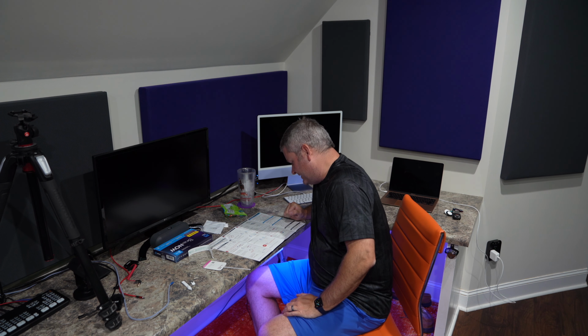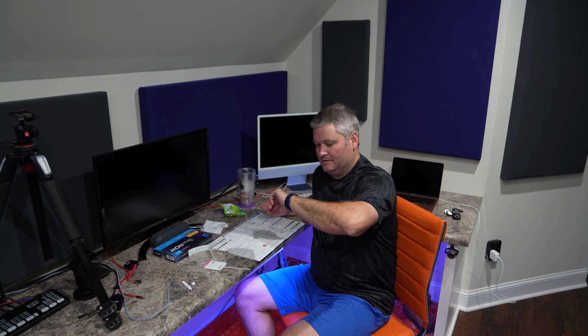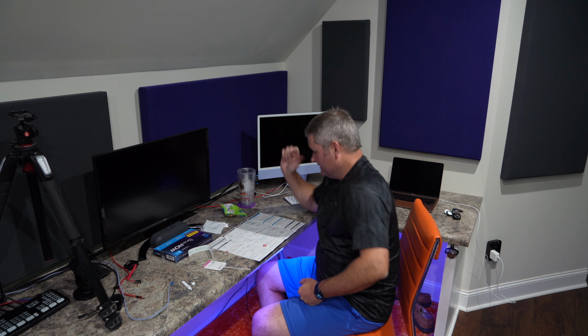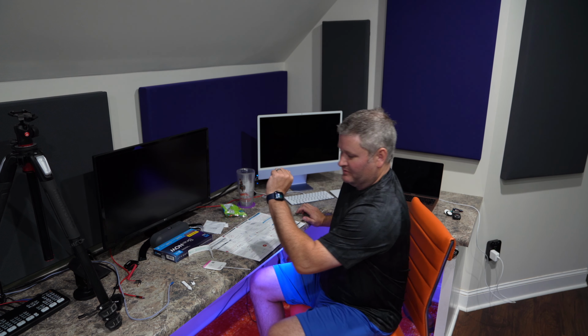Now, wait 15 minutes. Do not read the result before 15 minutes or after 30 minutes. Hey Siri, set timer for 15 minutes. Okay, 15 minutes and counting. So now we're just going to sit here and wait for Siri to finish its thing. I'm not going to waste my camera battery, so I'm going to come back. We've got 14 minutes and 38 seconds remaining.